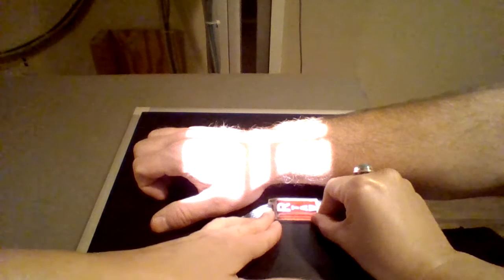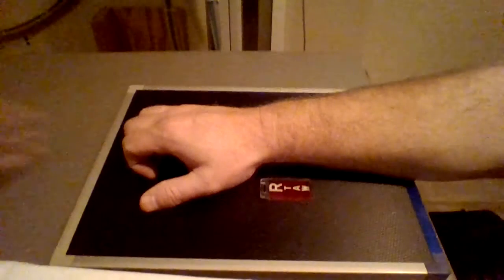And we're going to place your marker. Patient shielded. You got your kVp set, and you're ready to take your PA projection of the wrist. And we're going to move on to the second shot, which is going to be a PA oblique. We're going to do a medial and a lateral oblique.